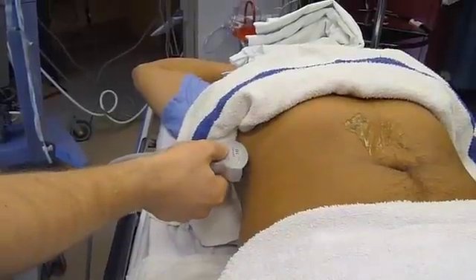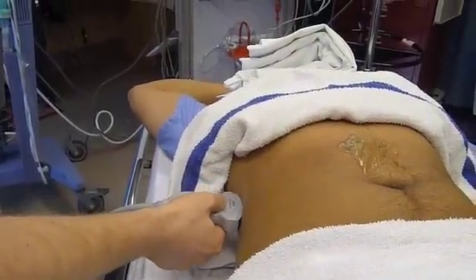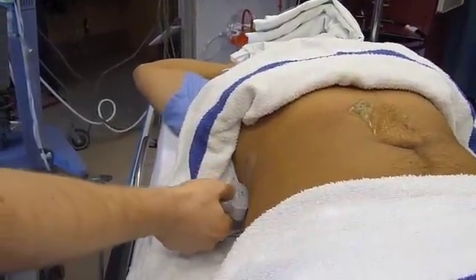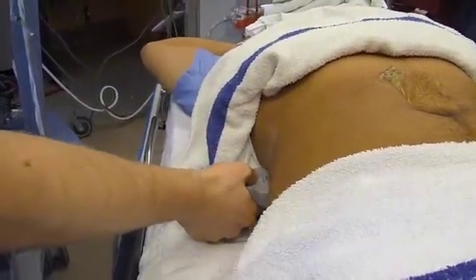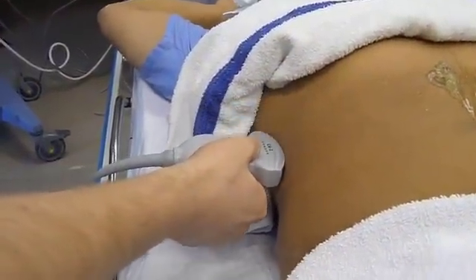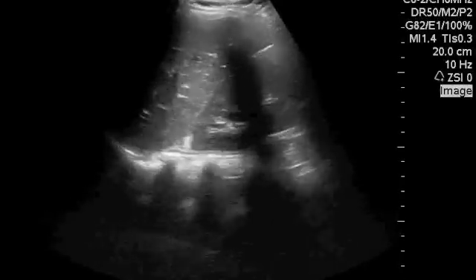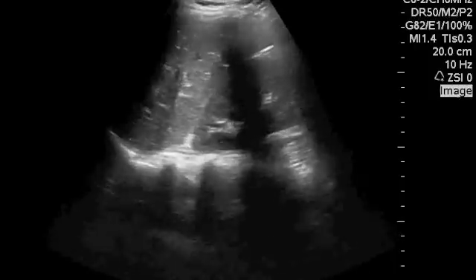Let's start with the right upper quadrant — that's where you're most likely to find free fluid. Hold the probe at the level of the xiphoid and move it anteriorly and posteriorly until you visualize the kidney. Here's what that looks like on the screen — you see the kidney coming into view. Once you get the best kidney you can find, stop at that level.